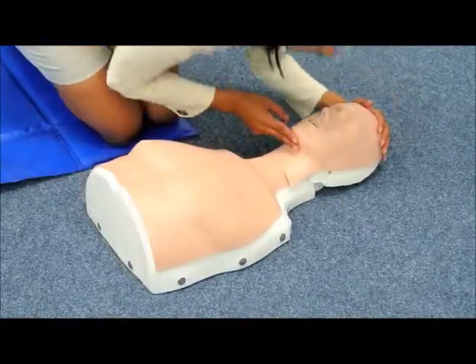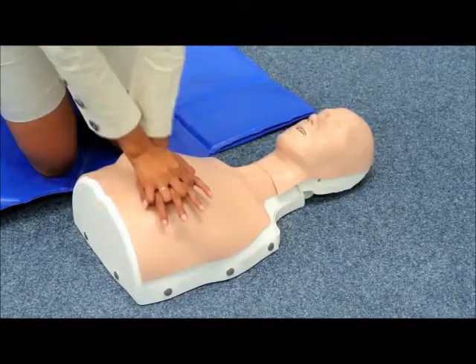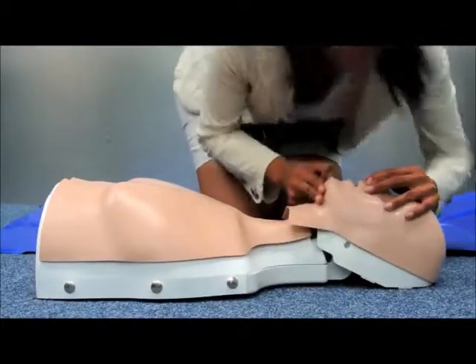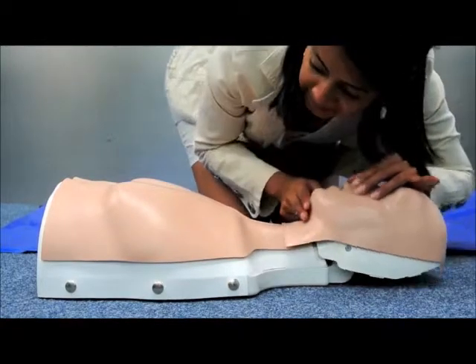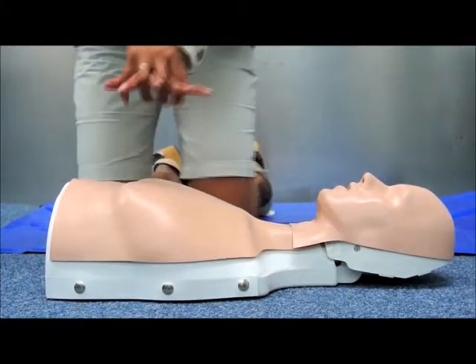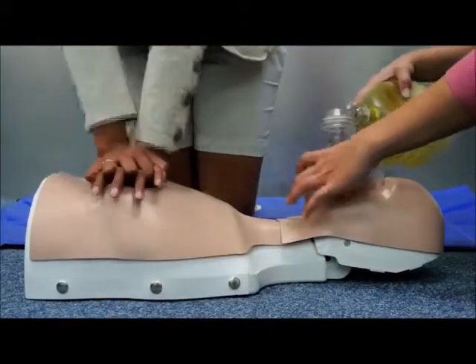With Basic Billy, you can teach basic CPR like chest compression and mouth-to-mouth ventilation. Additionally, a resuscitator may be used for ventilation.